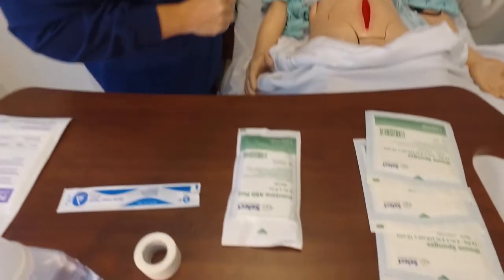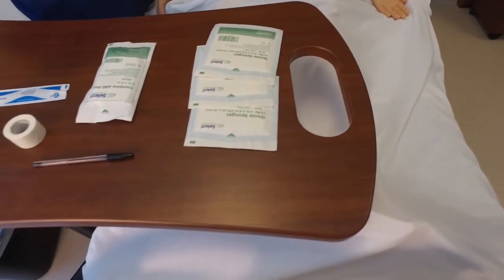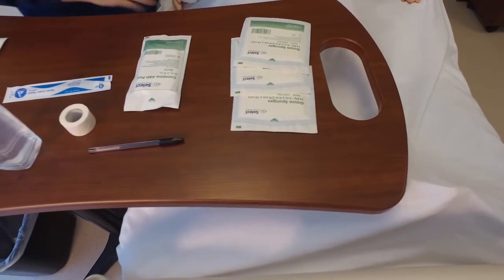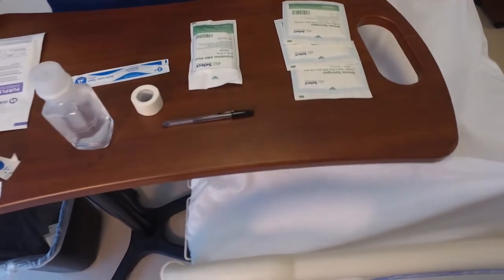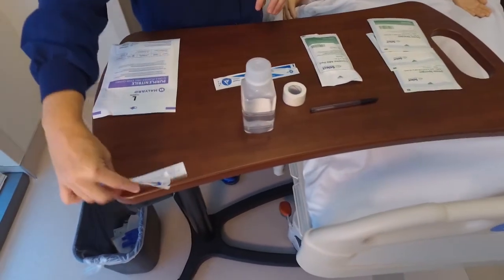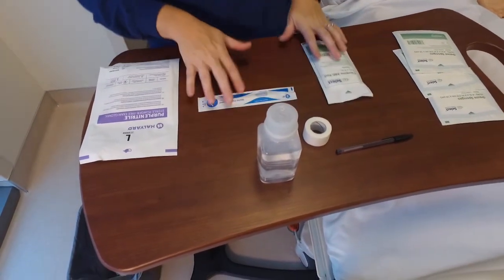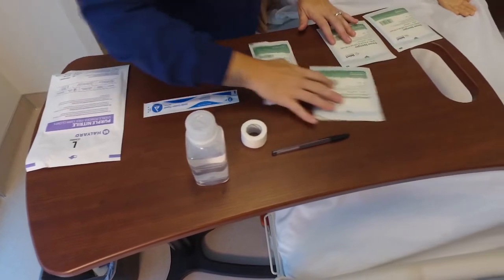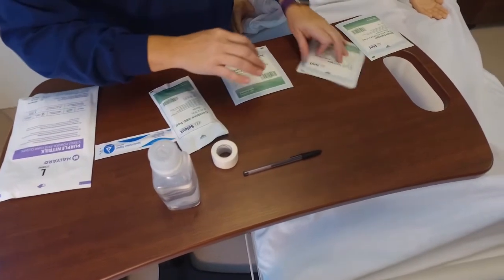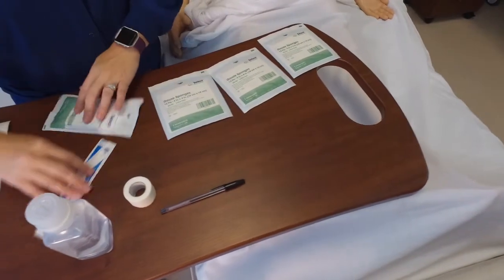The nurse will set up the table with supplies arranged in the order in which they will be used, leaving enough room at the end of the table for opening and donning the sterile gloves. The nurse begins opening the sterile packages consistent with sterile technique.